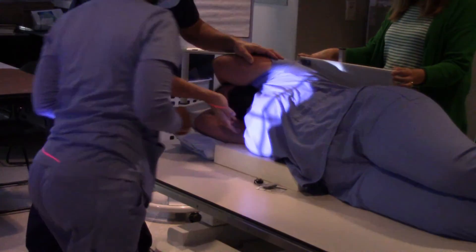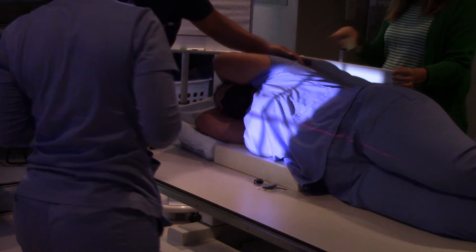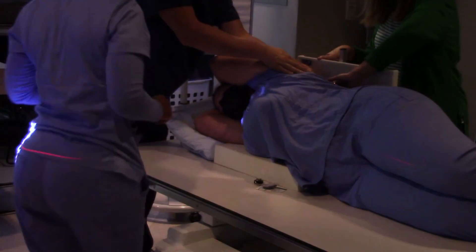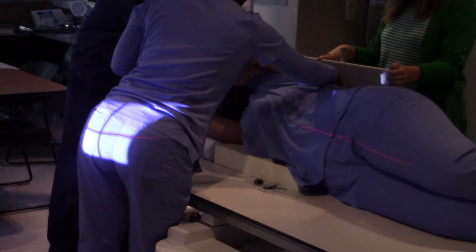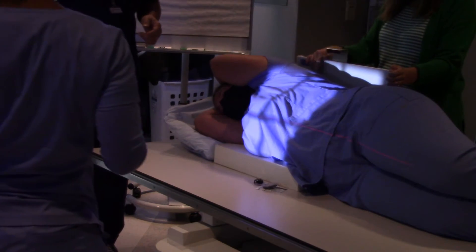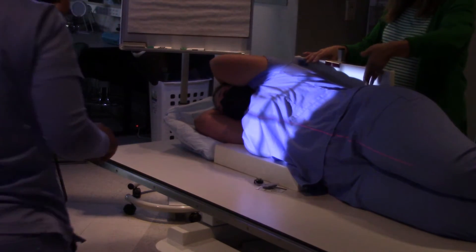The patient's jugular notch, a hand's breadth below — that's one way to center. The other thing you can do is feel for the patient's scapula and find where that is. If you see light on the wall, your collimation is open too much.